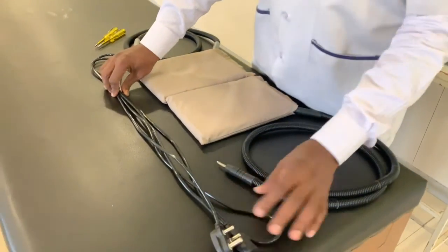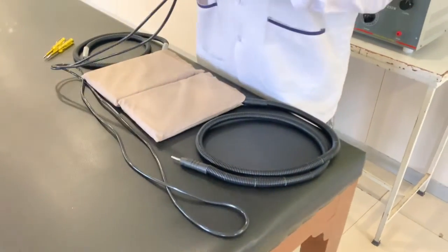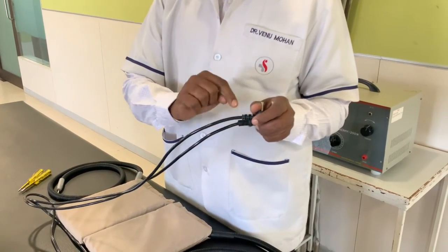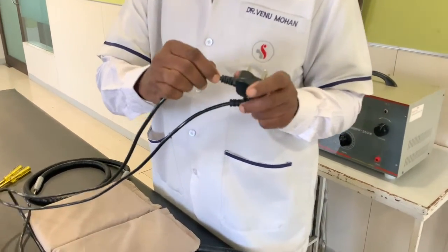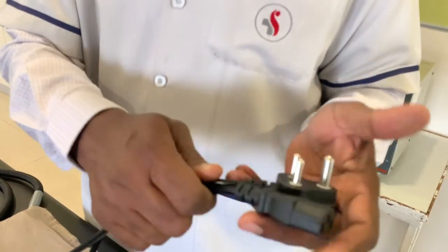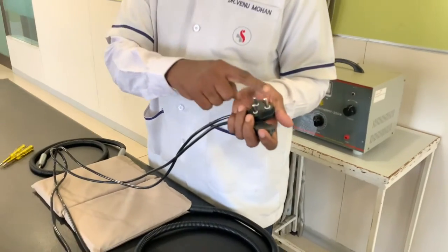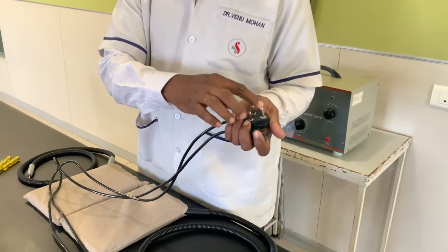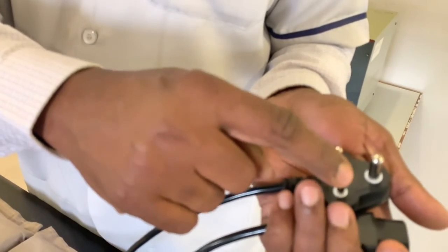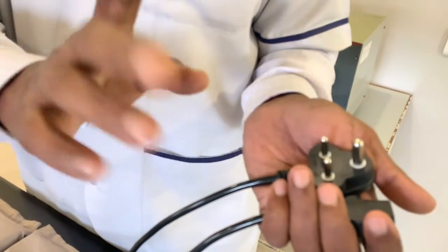Then we have the power cable. This power cable needs to be checked very carefully, because generally the site of damage is the neck of the connection, that is the neck of the plug and the neck of the socket. Generally these are the ones which get damaged. It is a 3-pin plug. The first one is the neutral, this is the earth connection, neutral, and the live wire. So these are the 3 points.